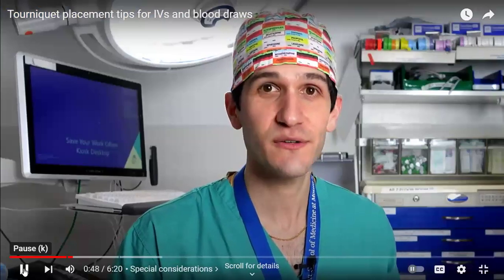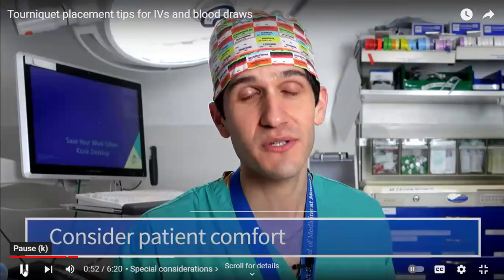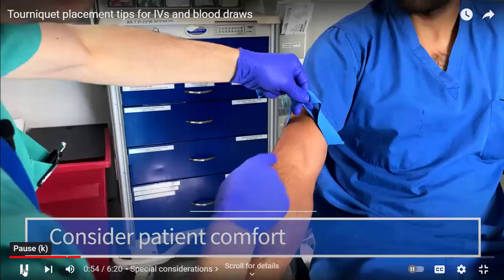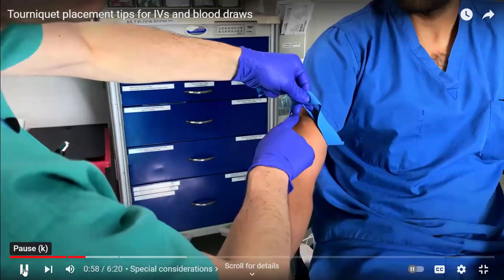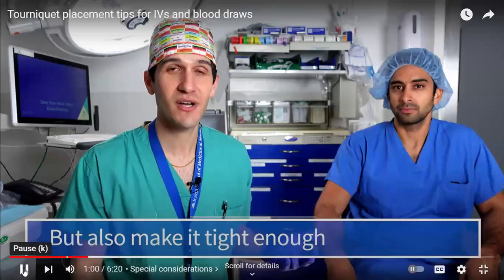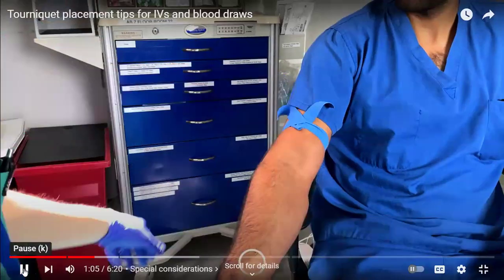Placing a tourniquet is actually a lot more nuanced than one might think. For one, you have to consider patient comfort. This is going to be tight, but if the patient has any body hair, you don't want to get that entrapped in the tourniquet. You also need to make sure it's tight enough to cause significant venous pooling in the patient's extremity so that you can actually get blood return in your catheter.